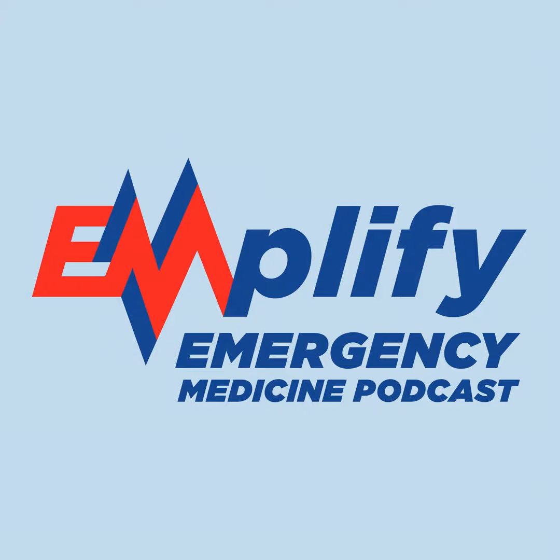And similarly, if you're intubating someone because of cardiac arrest, if you see an abrupt rise in that end tidal or their waveform capnography, then that is usually pretty strongly associated with return of spontaneous circulation. And so sometimes we will use that to be like, oh, we probably are going to have return of spontaneous circulation on our next pulse check.